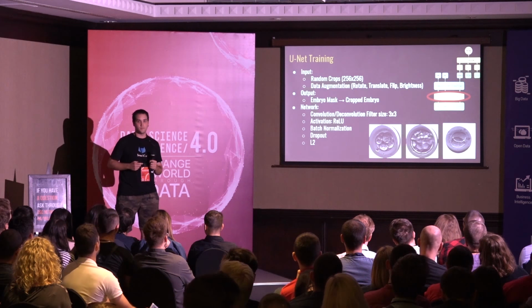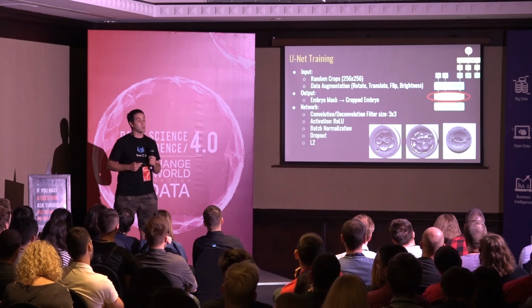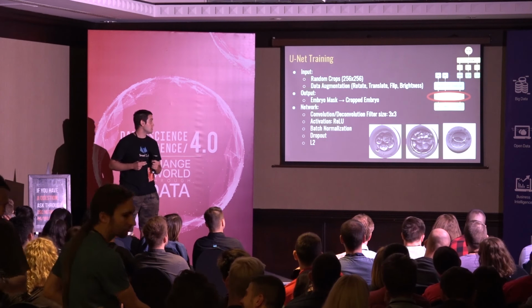We used 256 by 256 random crops from labeled embryo images.